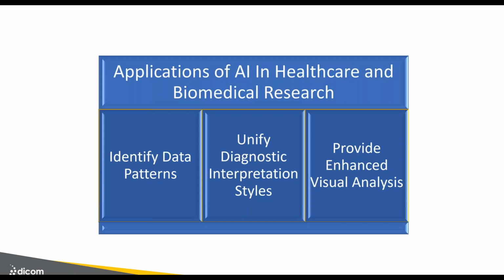And then lastly, a machine can outperform the human eye when analyzing an image study. So it has more resources to examine each pixel and perform a comparison against all previous data it's analyzed in the past. That's a nice tool to assist the radiologist in their interpretations.